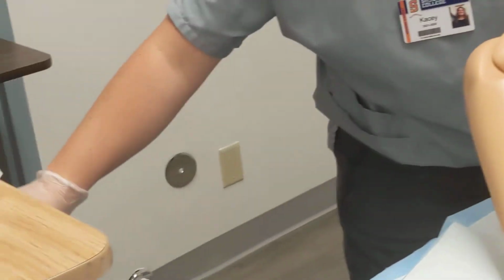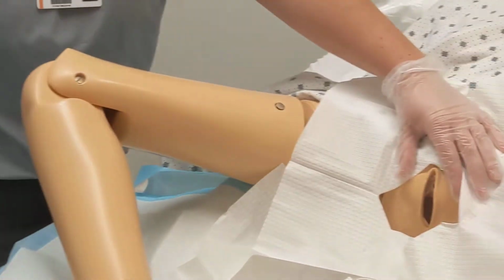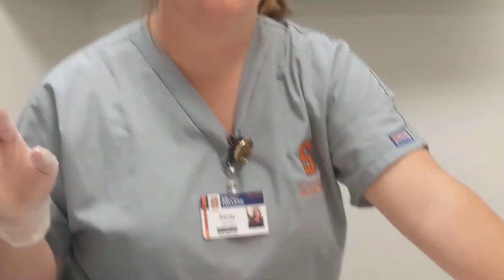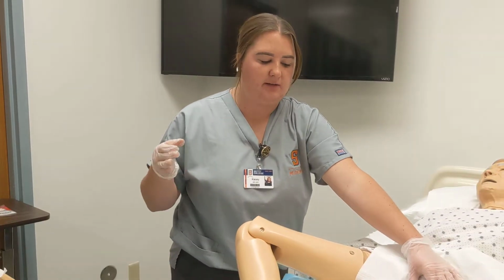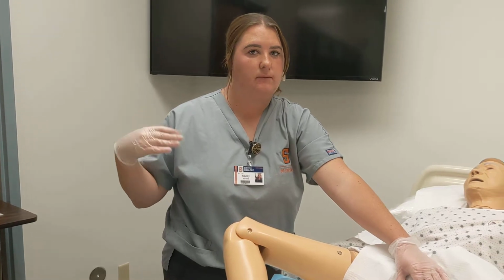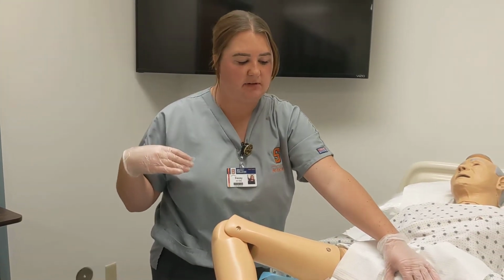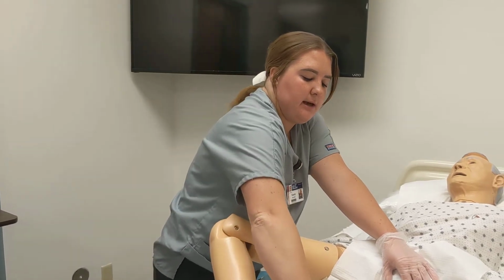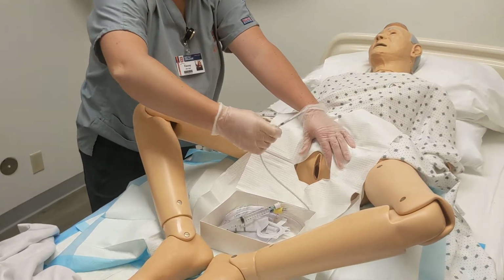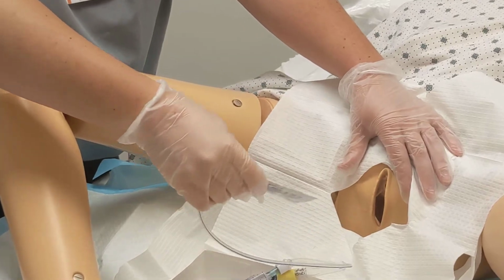And you're done with that. And now we have our catheter already lubricated. Now if this was a male, we would insert 10 mLs into the penis first. Since we have a woman here, we have lubricated 2 to 3 inches of it.